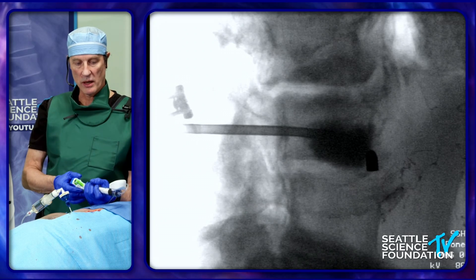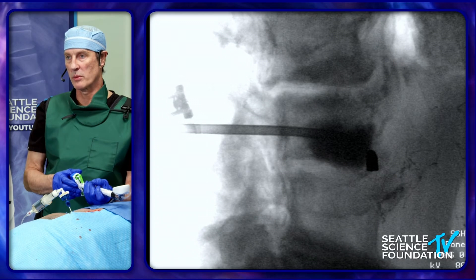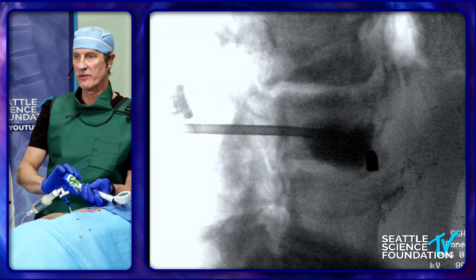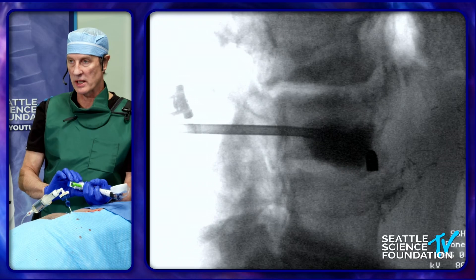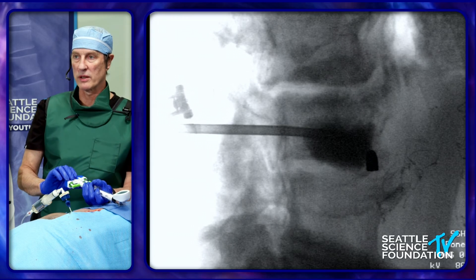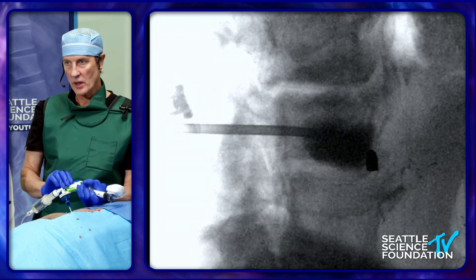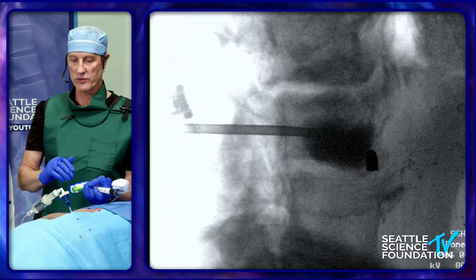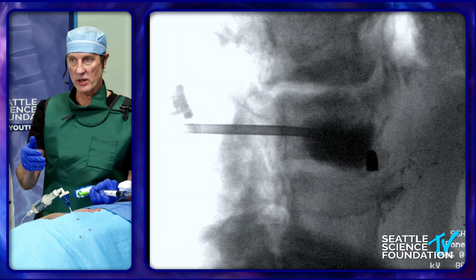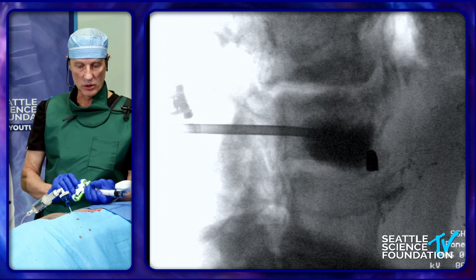The extravasation of cement into the disc is important for two reasons. Number one, in an intact healthy disc it causes premature degeneration — but most of these patients are about 75 years old, so that's not really an issue. More importantly, the greater the volume you extravasate into the disc, and the farther anteriorly you extravasate, the greater the propensity for an adjacent segment fracture. But bottom line: if it starts to extravasate, wait — time is on your side, because cement hardens faster in the body than on the back table. So you can wait, let it harden, plug the area of egress, and then keep injecting.